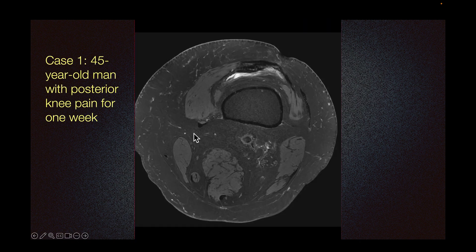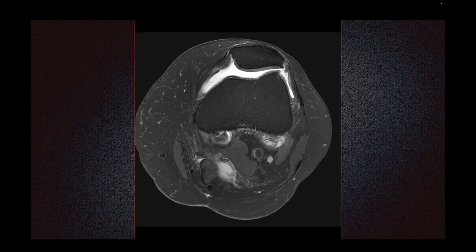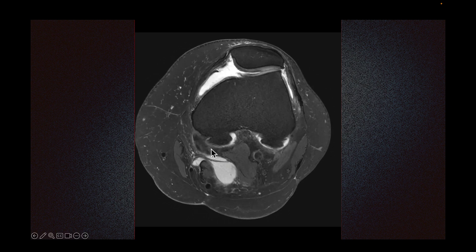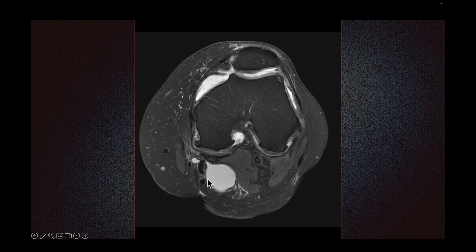Let's look at an abnormal case. We have a 45-year-old man with posterior knee pain for one week. This is semimembranosus, this is semitendinosus — again, cherry on top. The medial head of gastrocnemius would originate somewhere in this region as I scroll down. Here we see the medial head of gastrocnemius originating, and we have a cyst in between the semimembranosus and the medial head of gastrocnemius. So this is a Baker's cyst.